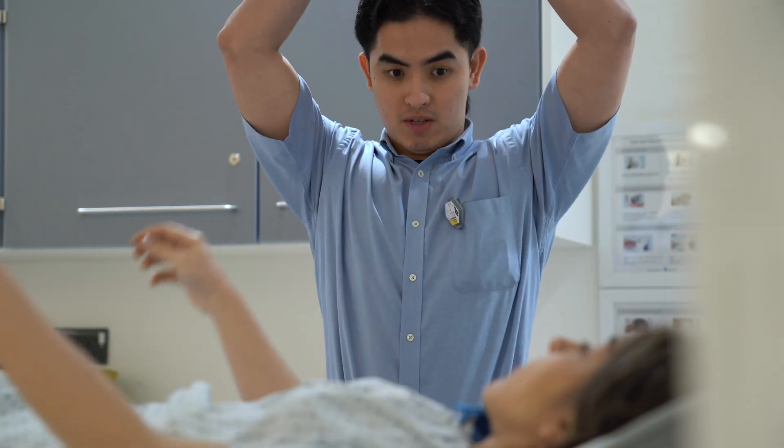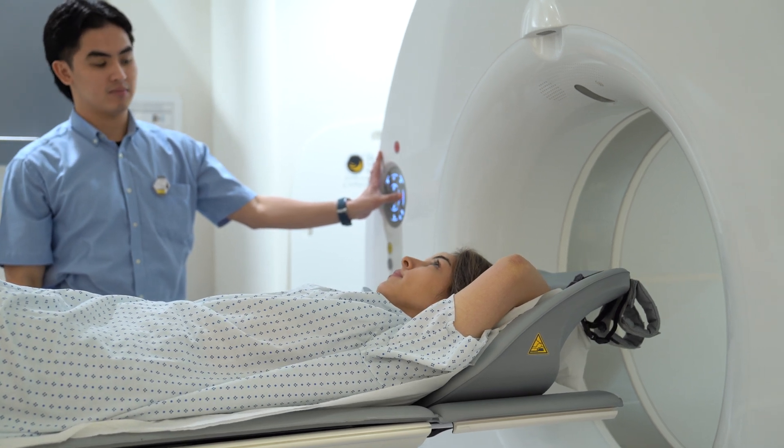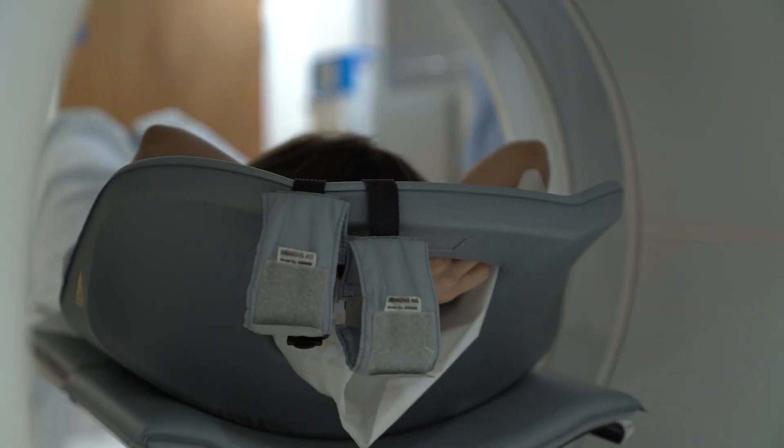We will then take the patient to the scanner and ask them to lie back on the bed and keep still for around 20 minutes. Depending upon which type of PET CT scan they are having, the timing may vary. After the scan, the patient can drink plenty of fluids to flush the tracer out of their system and they should limit close contact with young children and pregnant women for 6 hours while the tracer leaves their system.